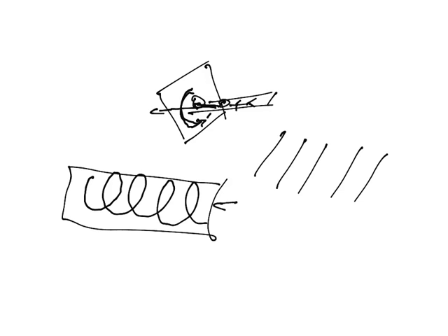As technology increased, as they came up with more and more efficient ways, not only of doing the mathematics behind the scenes, but also in terms of how to increase the efficiency of the X-ray generation and the detection and things like that, they're able to take a process that started in the prototype at 9 days and eventually got it down to 20 minutes and then 2 minutes and then half a second, and now we're down to literally a full body scan on the order of about 30 seconds.